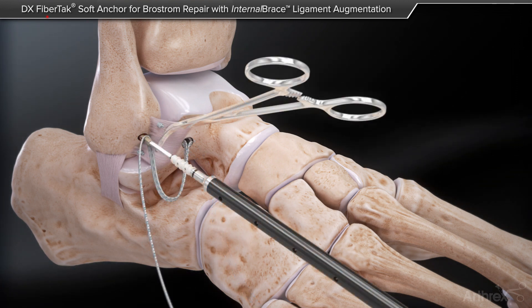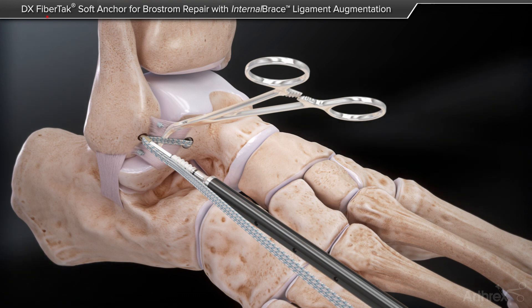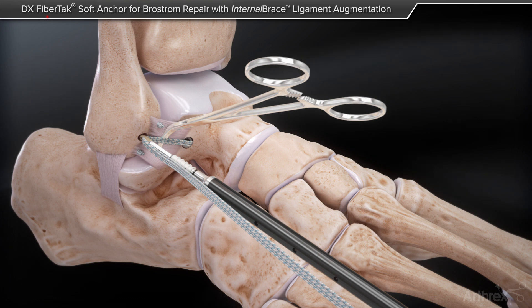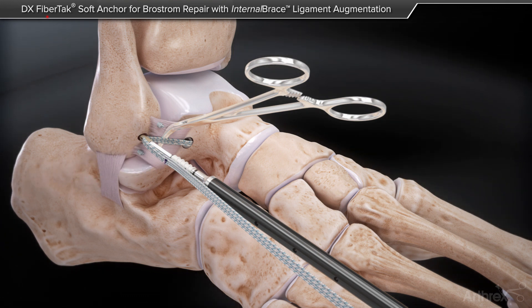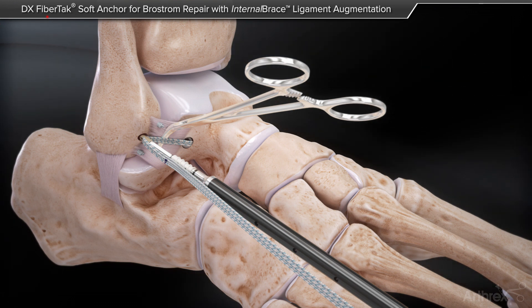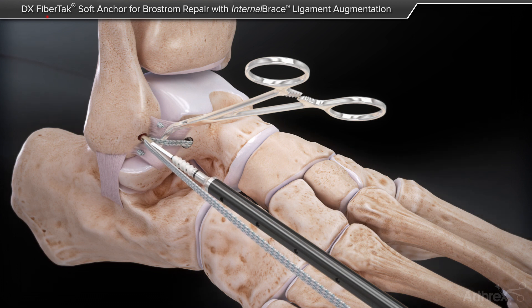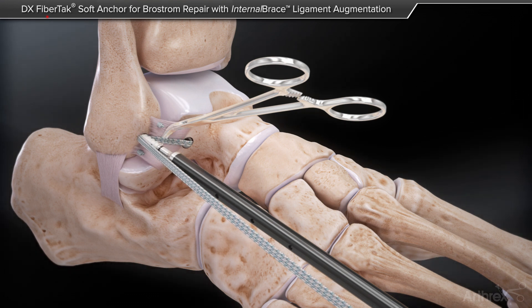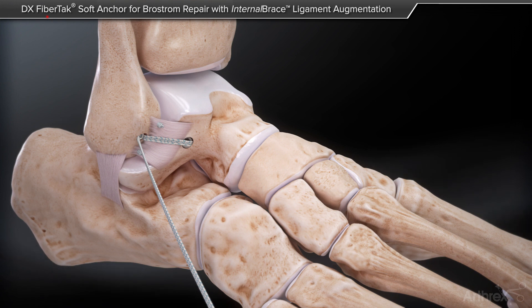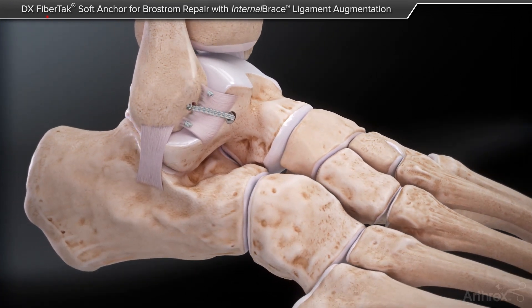Place the tip of the anchor to the origin of the fibular tunnel. A small curved hemostat may be introduced under the fiber tape to aid in tensioning, or utilize a marking pen to note the initial tension that should be set upon insertion. While keeping the foot in a neutral position and slight eversion, mallet the swivel lock handle until the screw comes into contact with the fibula. Final fixation is achieved by inserting the swivel lock anchor until it is flush with the bone. The excess fiber tape suture can be cut and the repair is complete.